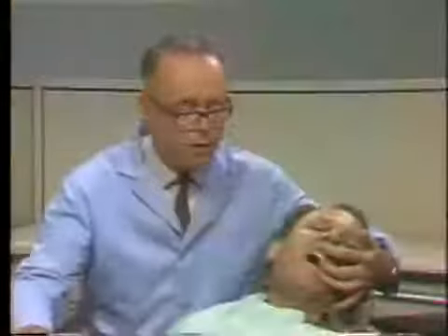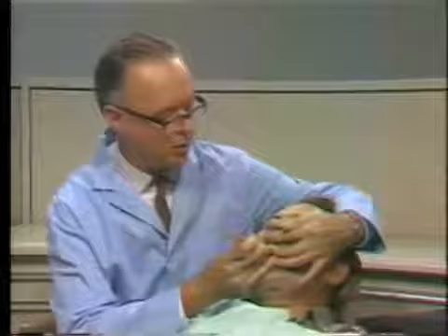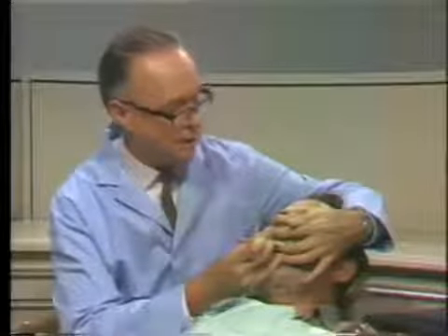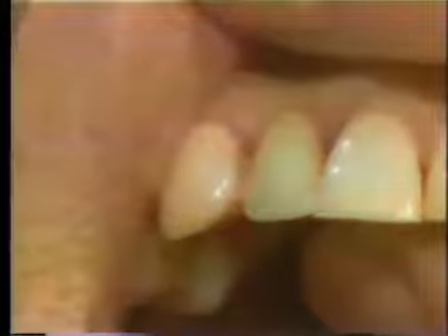And then we do the same thing on the proximal surface of the cuspid tooth. And if you just turn your head this way, we can do that. In this particular situation here with an imbricated tooth, I think you can see in here that the position of the gold margin there is quite critical. For example, if you were thinking of doing a 3/4 crown on this tooth, you would find yourself having to come way onto the proximal surface here in order to get the proximal retention groove. And in this situation, the pin ledge has considerable advantages.